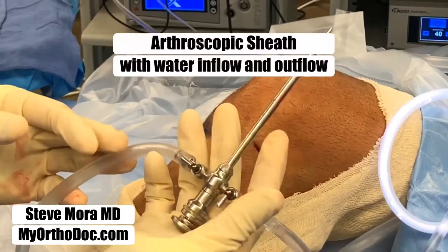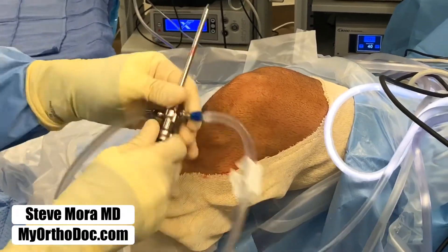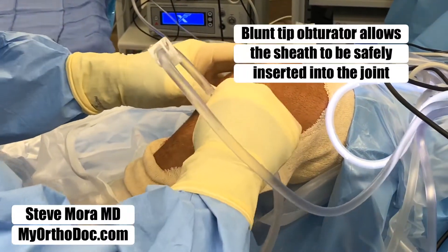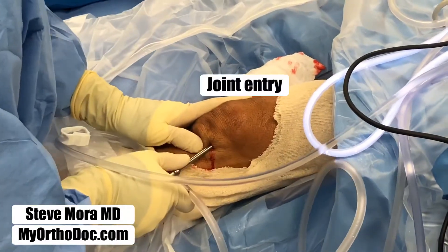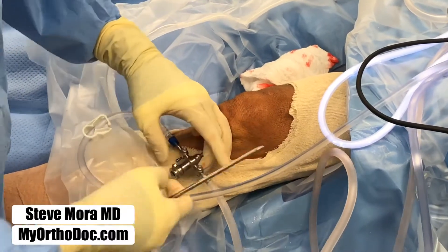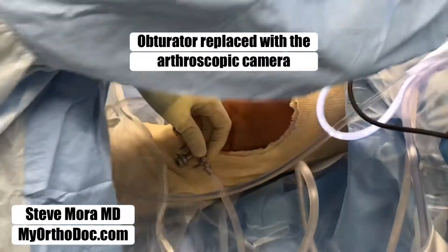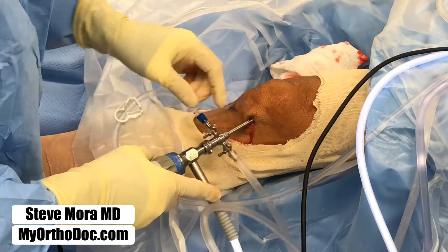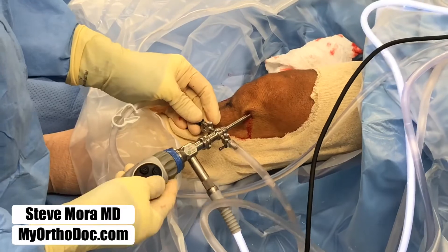This is the actual sheath for the camera and the light. It has an obturator — a blunt tip obturator. So we pop it into the joint, straighten the knee out, push it into the joint, make sure we're in. Remove this blunt tip obturator. Put the camera inside — the arthroscope that has a light source and a water source. And then we look at the screen.